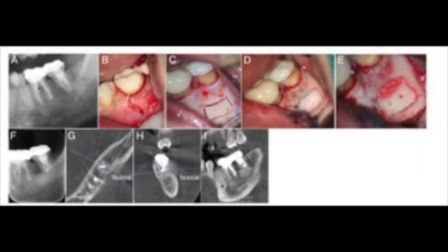One trick mentioned here is to use the thinnest ultrasonic tip, selected to ensure that the incision gap is as small as possible.